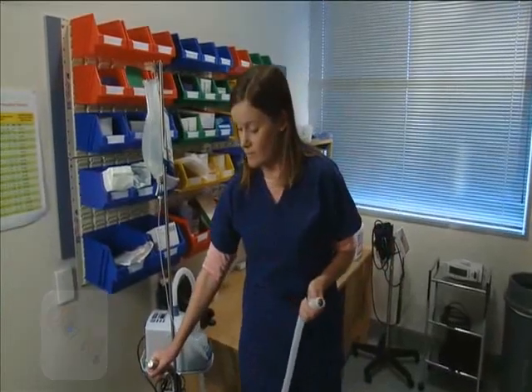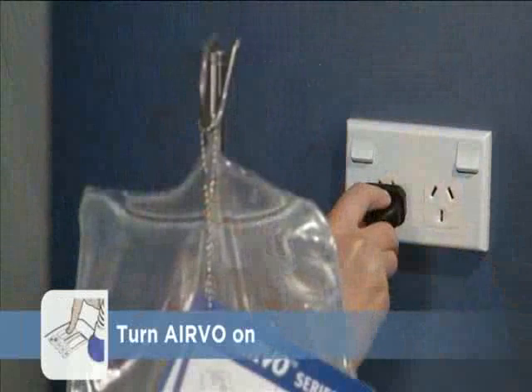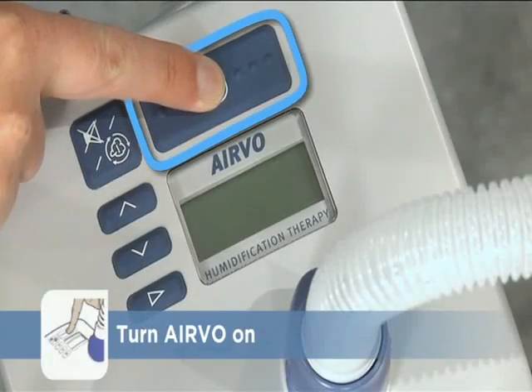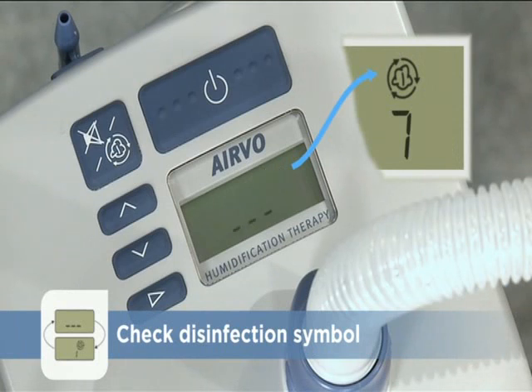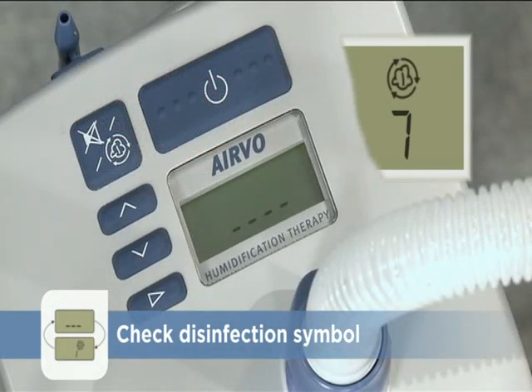The AIRVO is now ready for the patient. Plug the unit into the electrical supply and hold down the power button on the AIRVO to turn it on. While warming up, the AIRVO displays animated bars. You can check that the AIRVO has been disinfected while it warms up by looking for the disinfection symbol. Do not use the AIRVO on a new patient if the disinfection symbol does not appear. If the symbol does appear, the AIRVO has been disinfected correctly since it was last used.